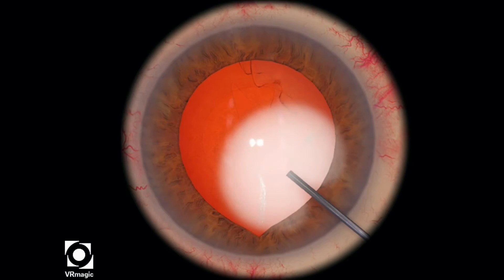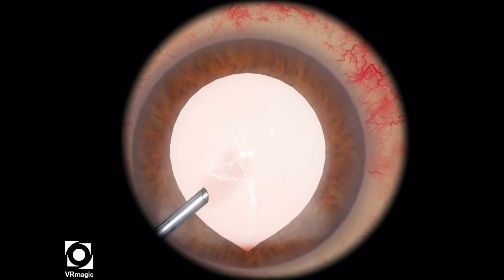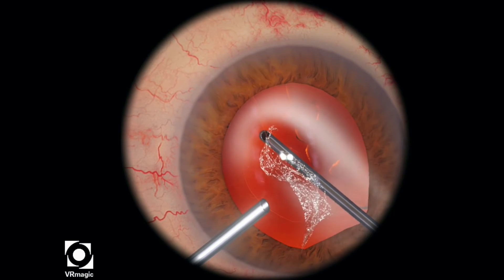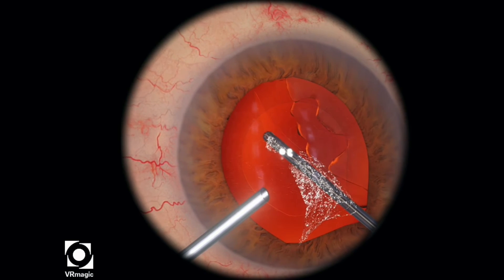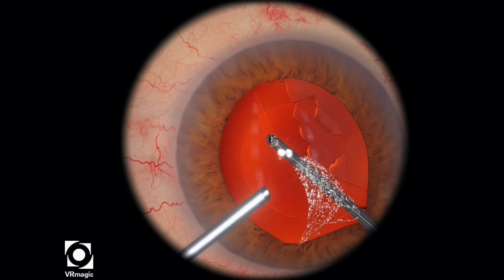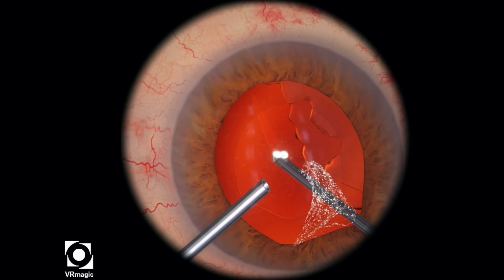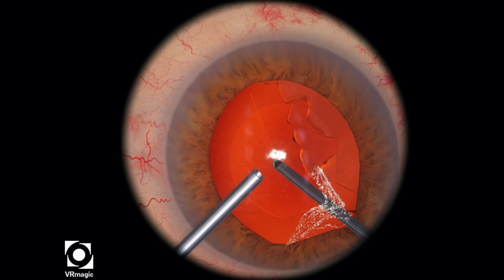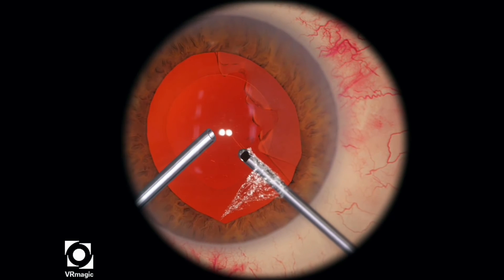Let's take a look at one more attempt. So you stain the anterior chamber and the bag with the triamcinolone, put in your irrigation, and then start with your cutter off until you reach the very bottom, and then you start with your cutter on. Then I aspirate the rest of the triamcinolone and start to cut up the rest of the vitreous. Notice how I'm doing it very slowly at the base first, before I start chasing after the vitreous that's in the anterior chamber. You want to make sure that you didn't tug or pull on any of the vitreous and bring it forward, because that will deduct you a lot of points on the simulator, and it will also make your life a lot more difficult.